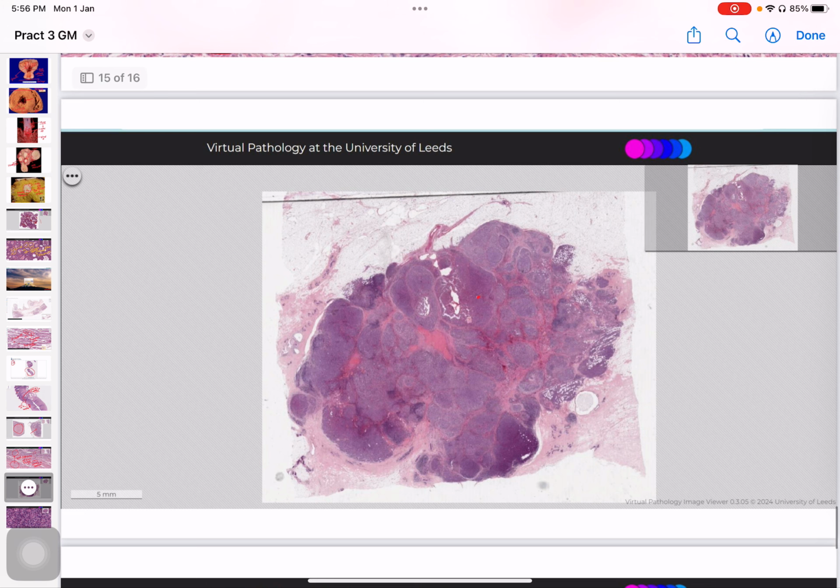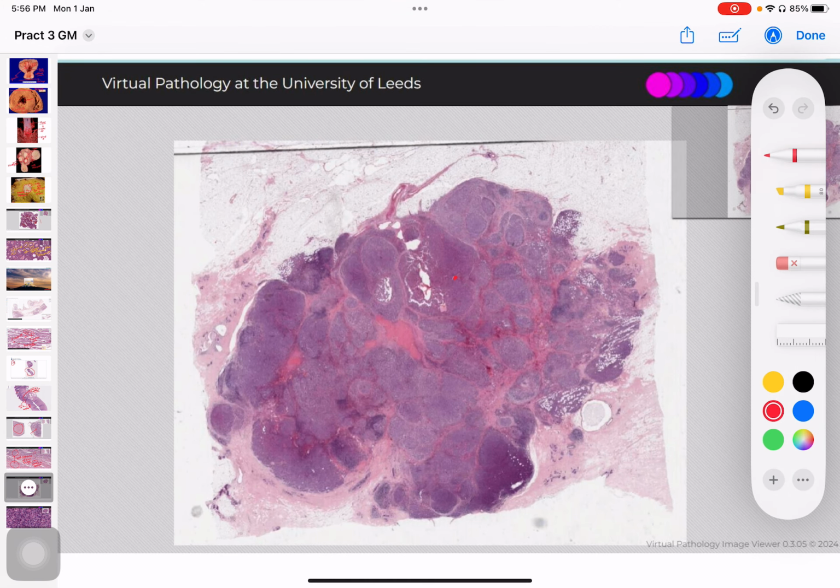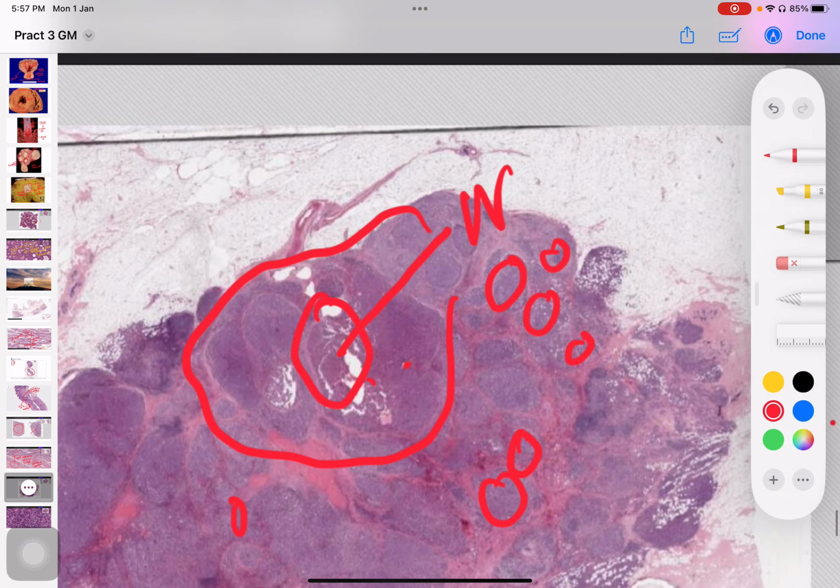The next image is malignant tumor. So you can see this is a tumor, invasive, because it has this large tumor and a lot of small tumor that sits within the stromal tissue. Okay, and apart from the large tumor, you can see this area has become dead, and this area is basically necrosis. Necrosis is a feature of anaplasia as shown before.